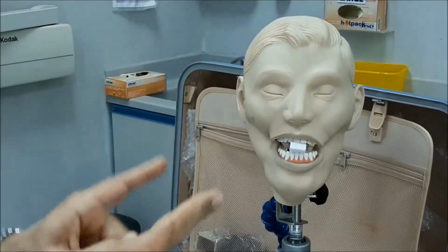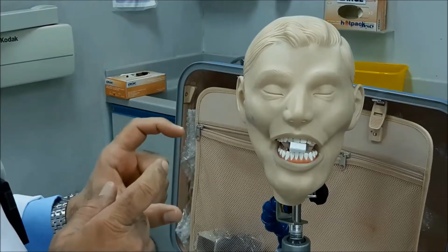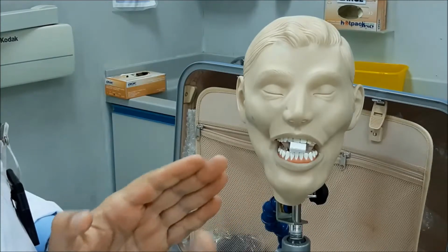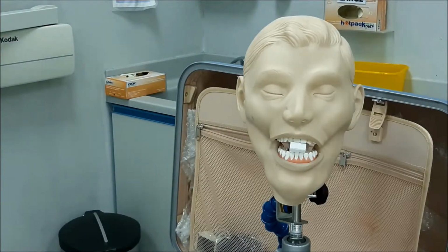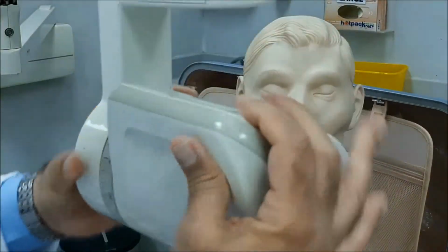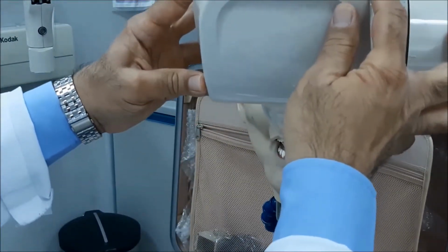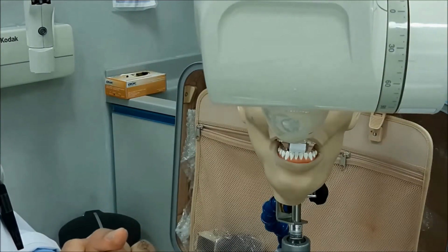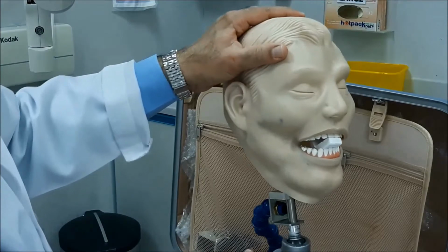Now, the difference in this type of sensor holder is that you don't have a guiding ring that will tell you where to direct the beam. So you have to know where your X-ray will be directed, and we're aiming for the upper central incisors. So our X-ray should be directed to the upper central incisors in this way. There is a chance of cone cut here if you don't know where to direct the X-ray beam.